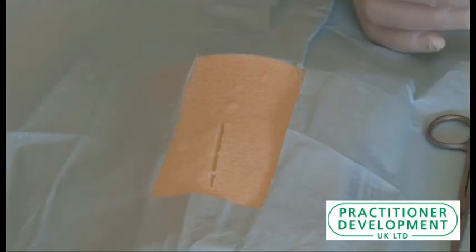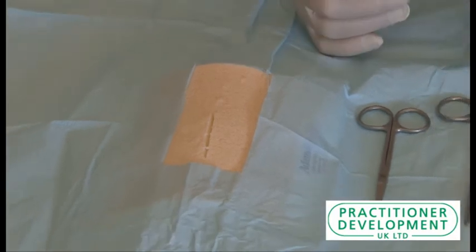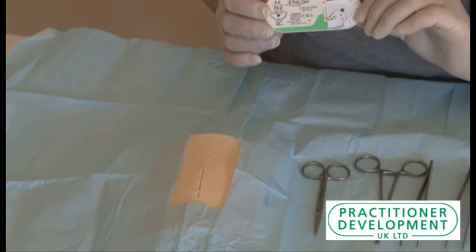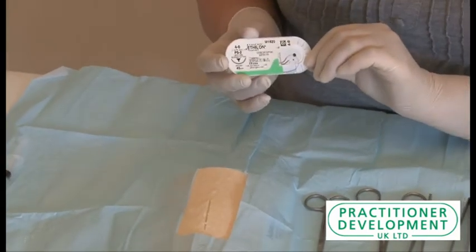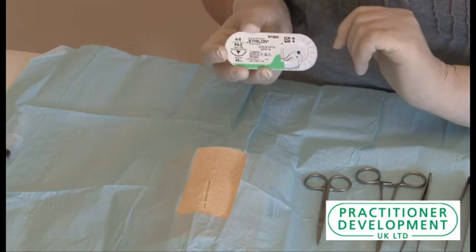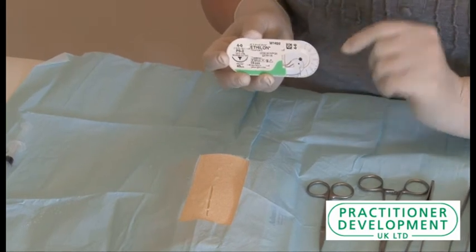Now we're going to look at the equipment we're going to use. For this sort of wound closure, I'm going to use an ethylon, which is a non-absorbable suture, a monofilament. You can see how the end of the needle projects through the packaging there, and that's so it's easy access.